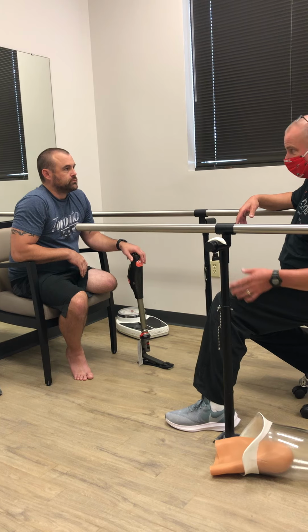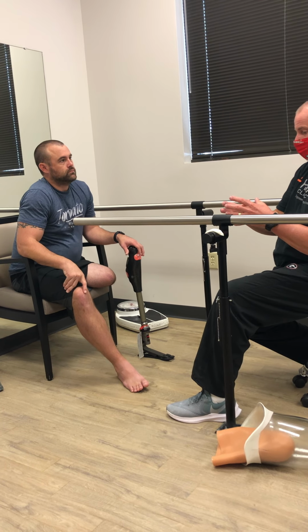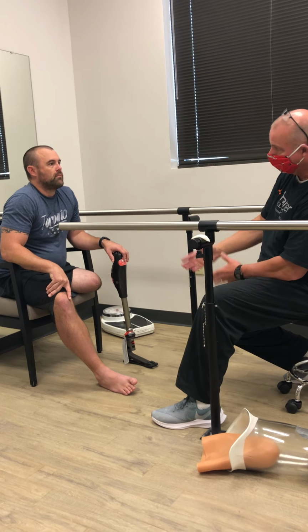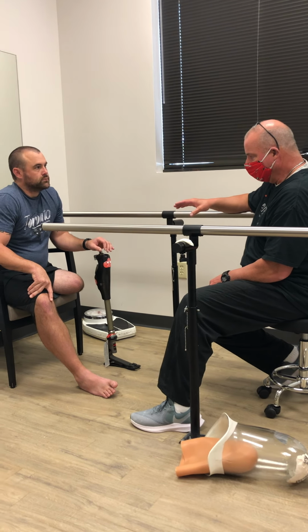Well, guess what? The socket doesn't fit like it did when you walked in because you were swollen. So when you leave, that volume's gone. Well, it's probably not going to be as comfortable if you don't make adjustments. Gotcha. Does that make sense? Yeah. So I mean, if that kind of gives you an idea.